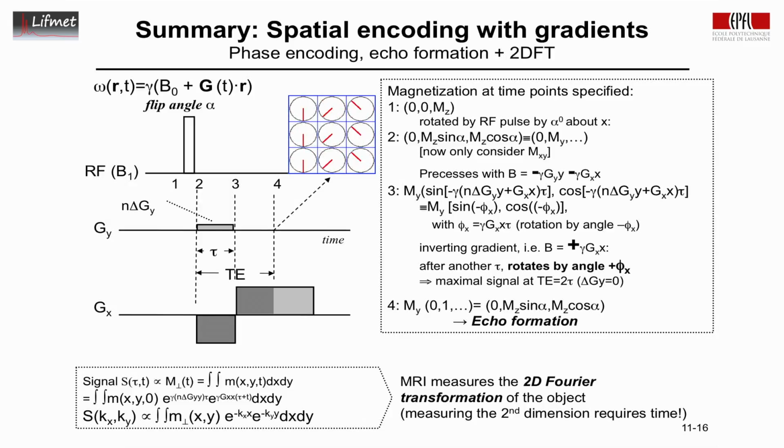We will try to rehash the process of phase encoding from a different perspective at the beginning of next week, to look at this with a slightly different optic so we can digest this better and understand how spatial information is being encoded.